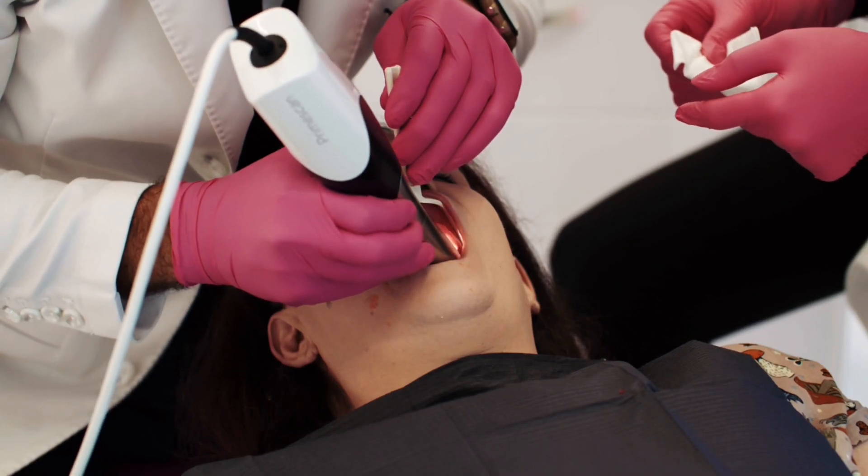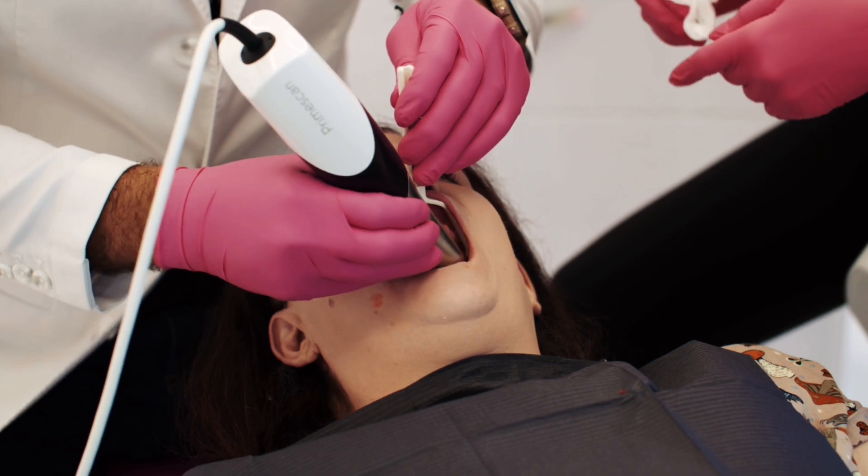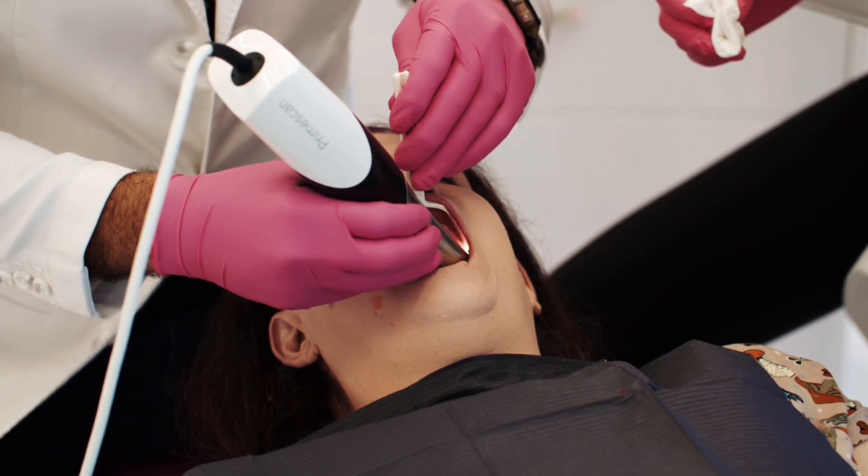This patient, like 30 million other Americans, is completely edentulous. She had given up on teeth altogether and has been using her gums to chew food for three years. She heard about my digital dentures and she drove five states to see me.